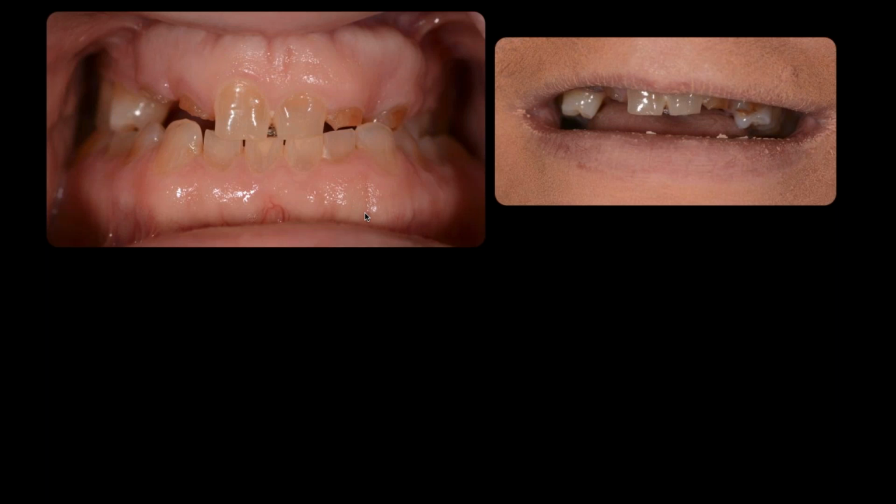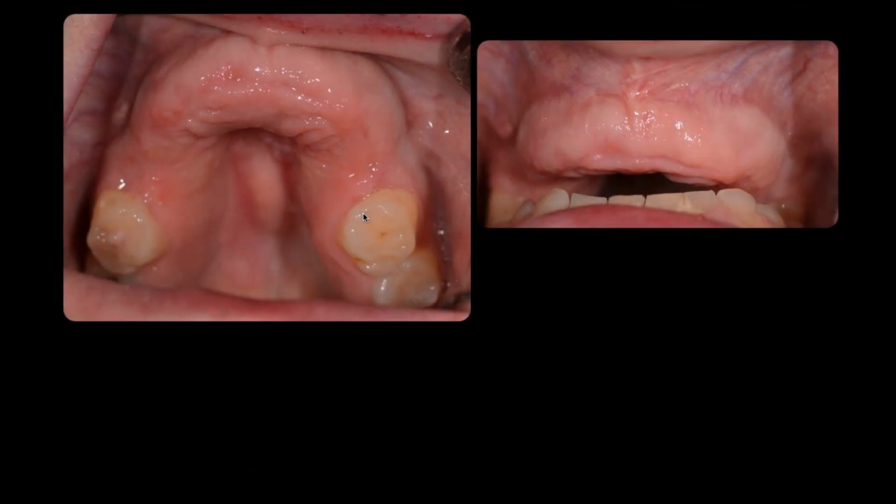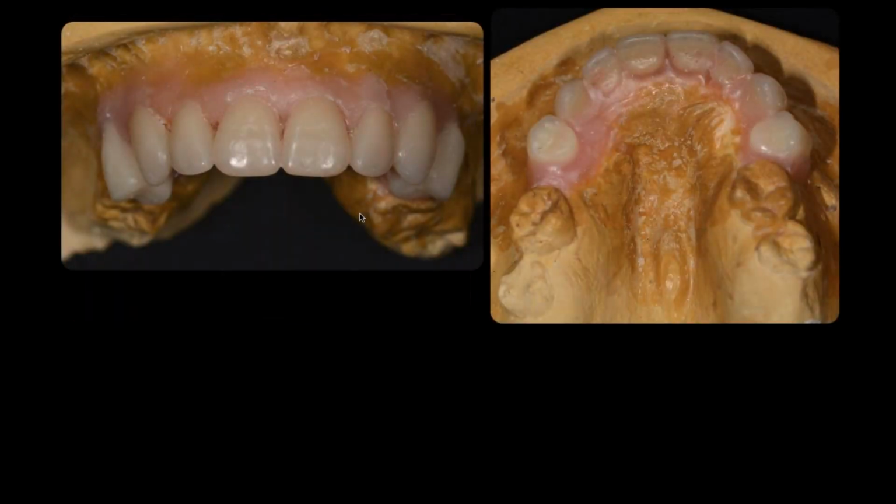She has aniridia, which is loss of iris tissue. But she has some dental problems along with it. It kind of follows it. And what we did is we grafted her with a tunnel on the alveolus, and then we came back and did implants. But the only way you know where to put implants in this kind of patient is to do a setup. And you really have to do a setup. So her restorative dentist went ahead and got models and did a setup and got teeth set up just so that it would be in occlusion and look good on her.